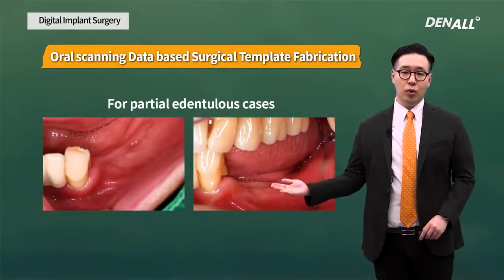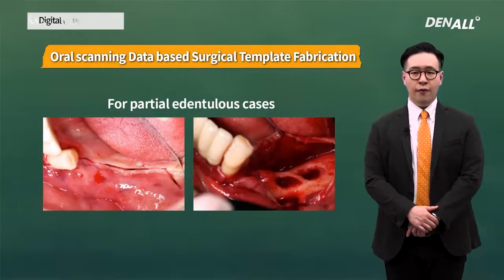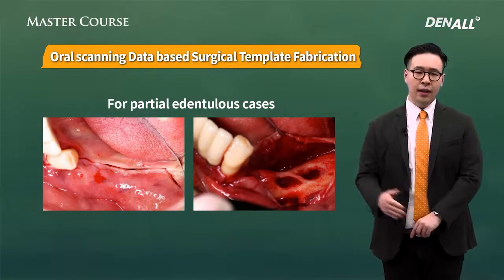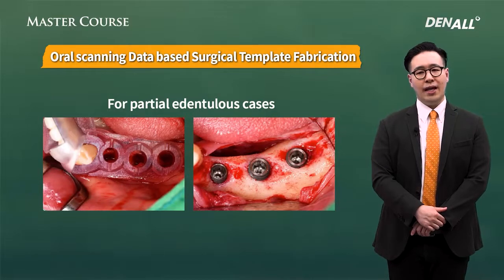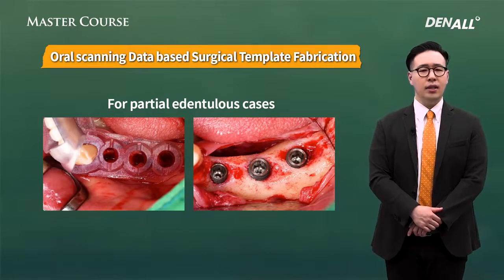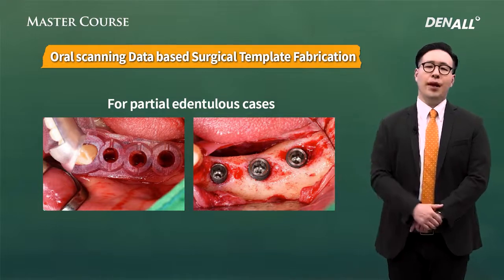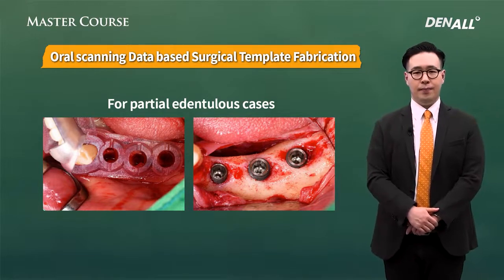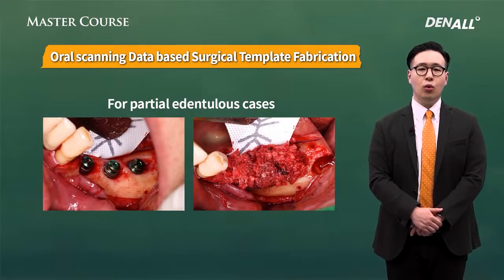This is the pre-op image. After an incision is made, buccal and lingual flap elevation, the bone is checked. The guide is used at the pre-planned position to accurately place the implant. A partly vertically exposed implant platform is observed. In general, bone is grafted up to 2 millimeters above the platform.